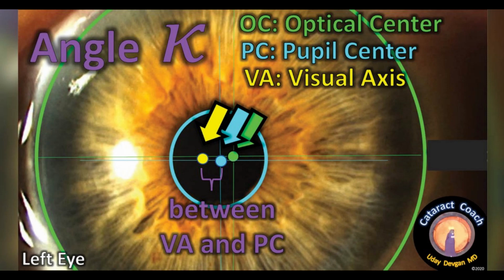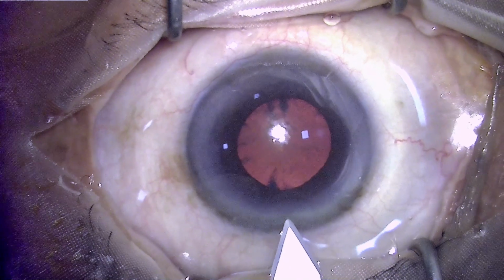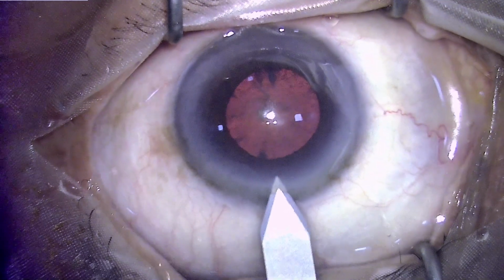And the center of the pupil is something which is again not usually aligned to this. But in a situation where we are planning a multifocal IOL, which will have a number of focal points, it's important to have the optical center and the visual axis coincide. And during surgery, how can we decide this? So keep the incision at the steep axis.